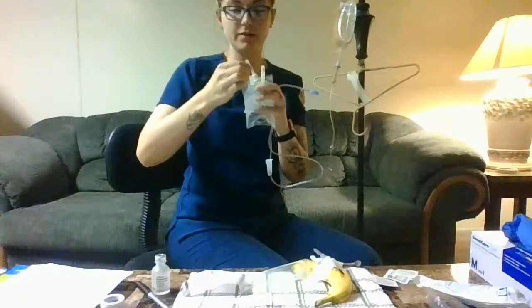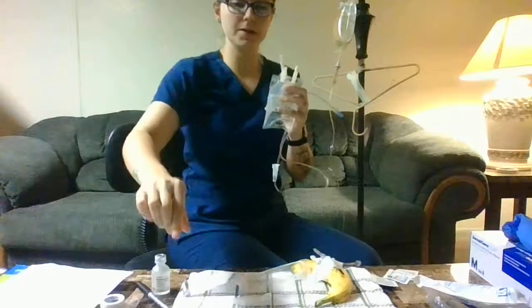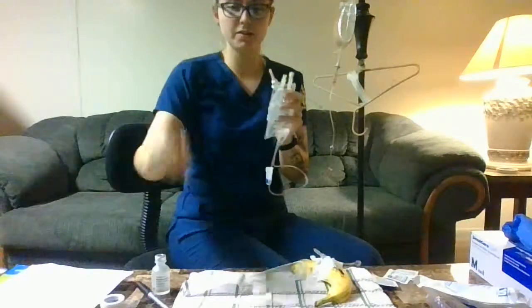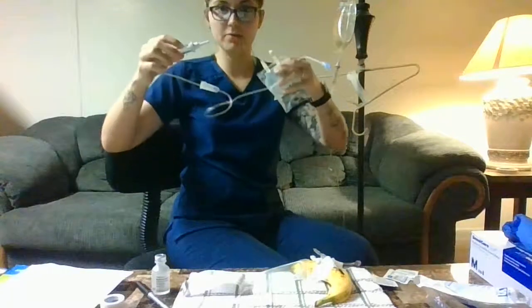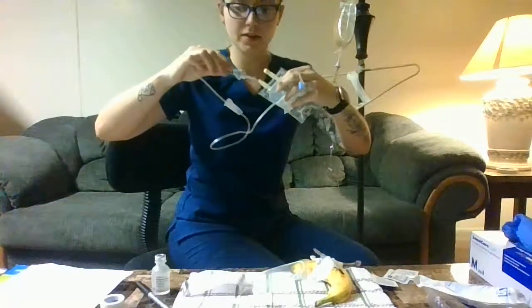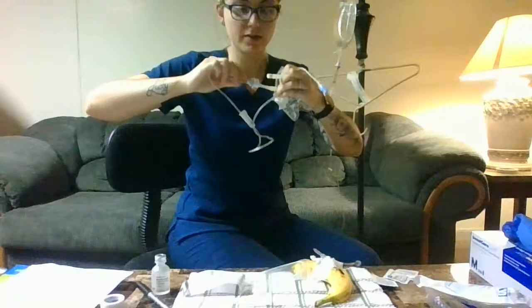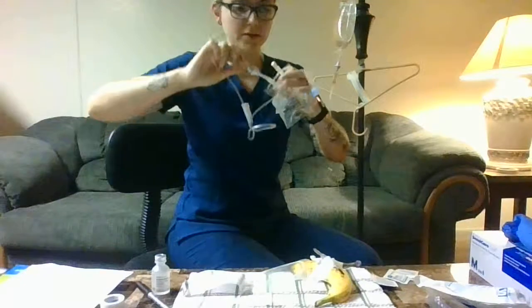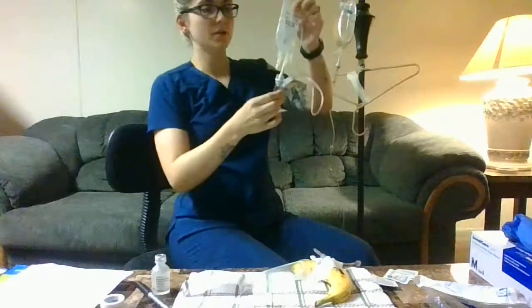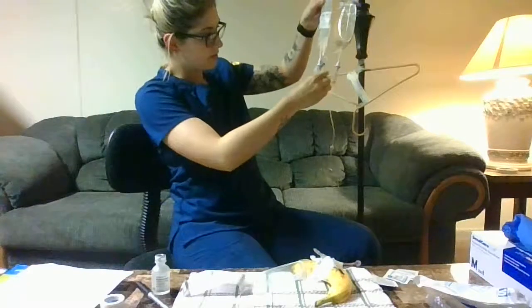I'm going to take off this here. You're going to take off the spike, and you're not going to touch the spike or the top of that to anything. You want to maintain aseptic technique. You are going to spike your bag. Okay. You're going to squeeze your chamber.